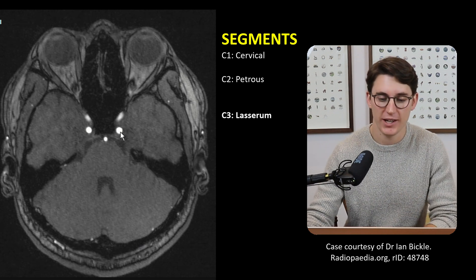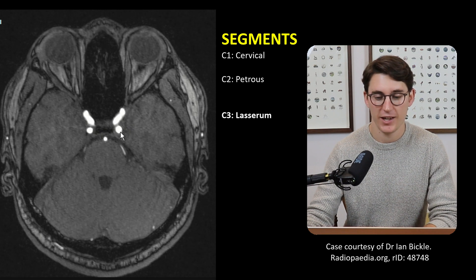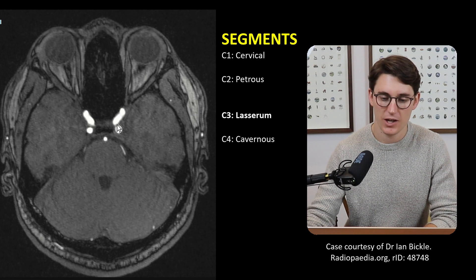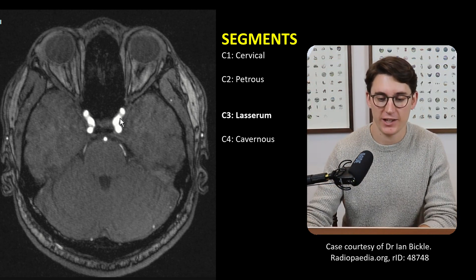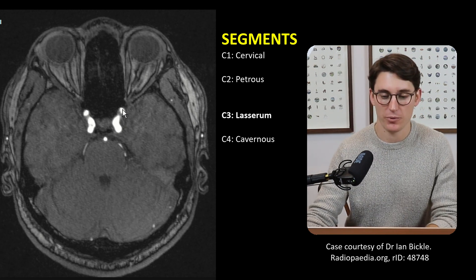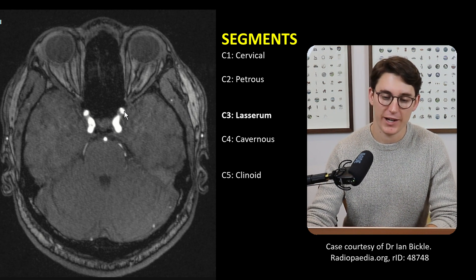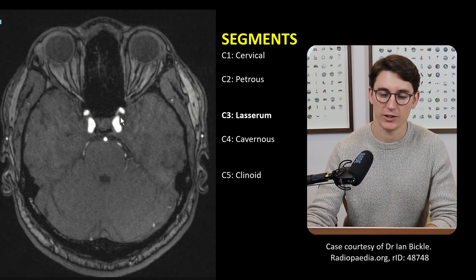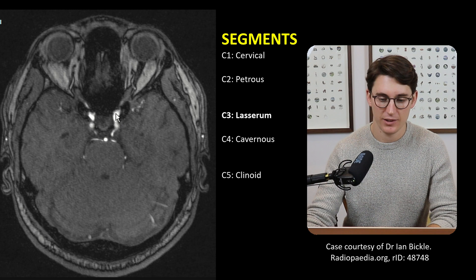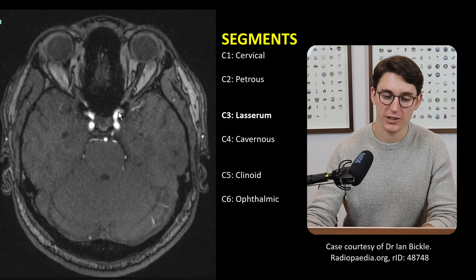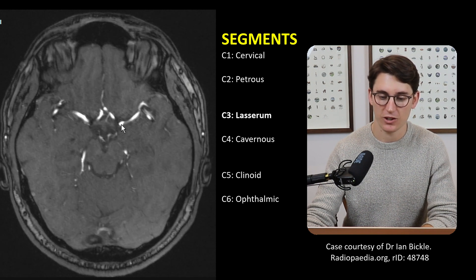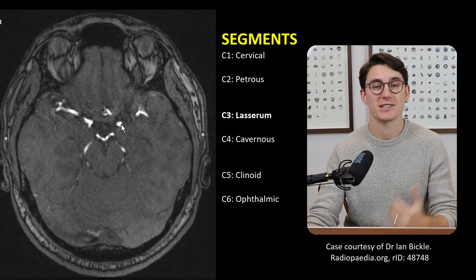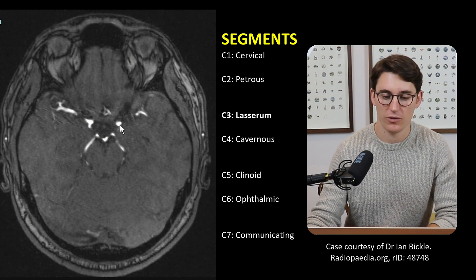Working our way up, we now expect it to go forward into our cavernous sinus — which you can see here going forward. This is C4, the cavernous segment of the internal carotid. You can see it then comes out anteriorly and goes upwards and posterior, looping around like we saw in that CT reconstruction. Where that loop happens is the anterior clinoid process, and this segment is C5 — it's called the clinoid segment. The segment that then bends back posteriorly is called our ophthalmic division, C6, before heading upwards towards the circle of Willis and giving off our posterior communicating artery and bifurcating into our anterior and middle cerebral arteries. That last segment, C7, is what's known as the communicating segment of the internal carotid artery.